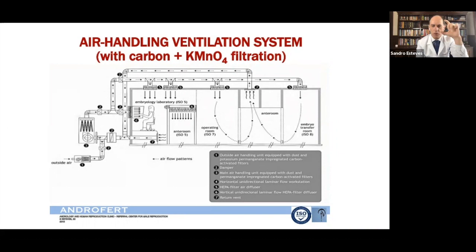We also have manometers installed to check the pressure differential. So there are several ways we could design labs and provide air handling separately, but as Jason said, if you design it properly, one unit could take control of it.